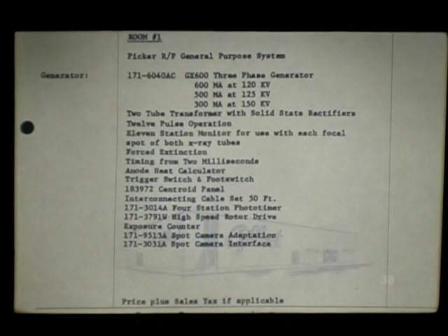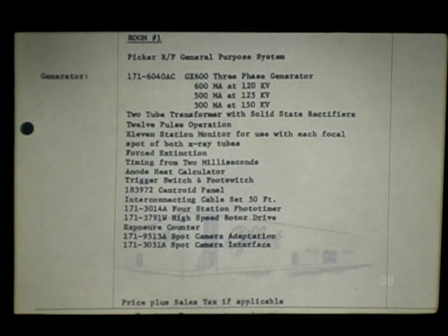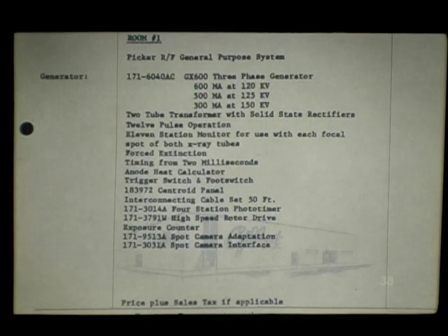Number 38. At a designated time, provide purchase specifications to the X-ray equipment manufacturers or dealers that wish to bid for the opportunity to sell their product. After reviewing the specifications, the vendors submit a proposal or bid that lists the equipment they have available and its cost.